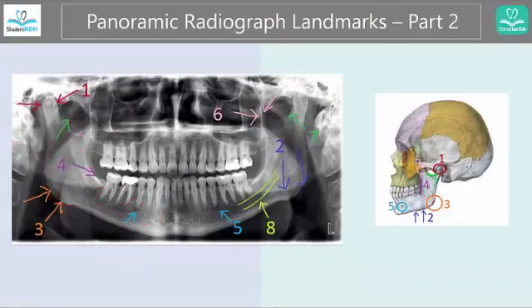Number four indicates this little area you see here on the skull. This is called the external oblique ridge, and this is the opaque — meaning the lighter area — on your radiograph here.